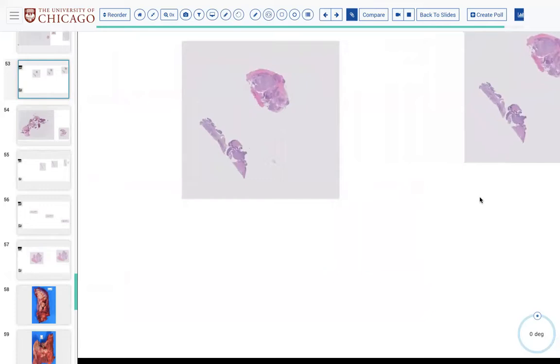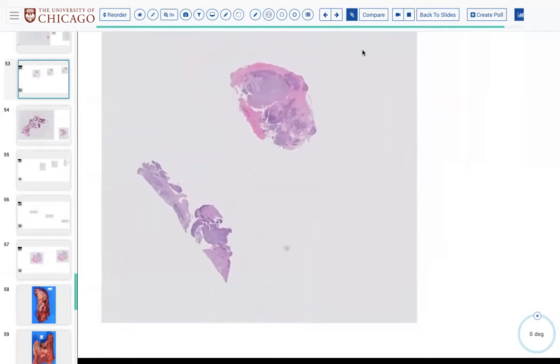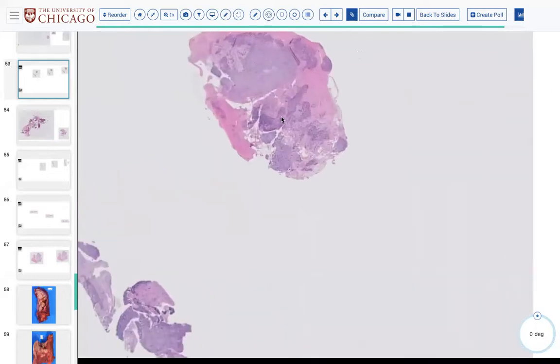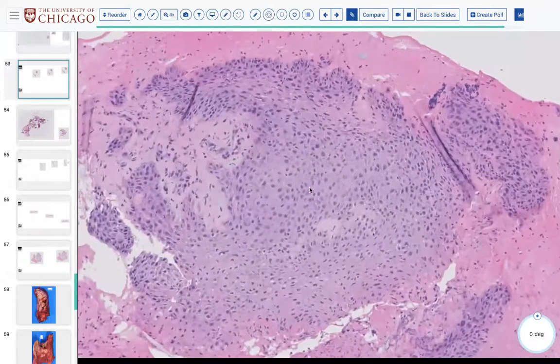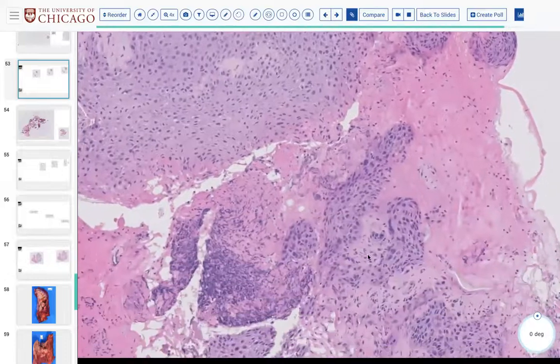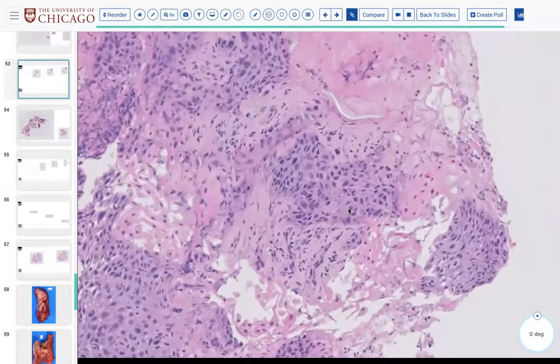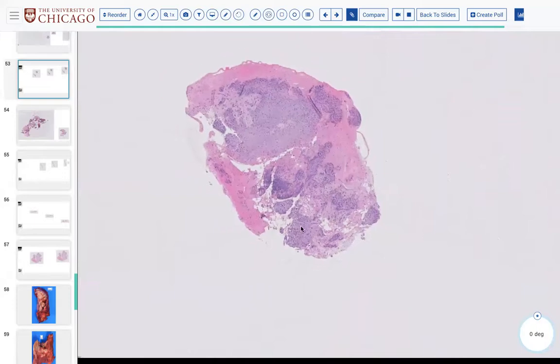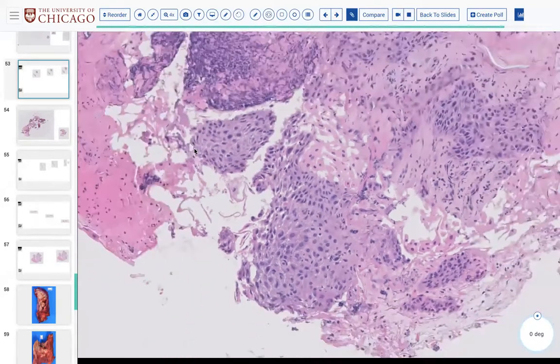So they're like, okay, fine, it's cancer. Okay, I'm going to take the mandible out. Now we have an anterior mandible margin for frozen. So, what they do, no, this is just the permanent. Sorry, this is the permanent of that before we move on to the mandible. So yeah, the permanent, I think you guys can agree, is pretty clear for cancer. But I'll send you guys this one. There's nice, really ugly cells. Okay, great. So that's the permanent.